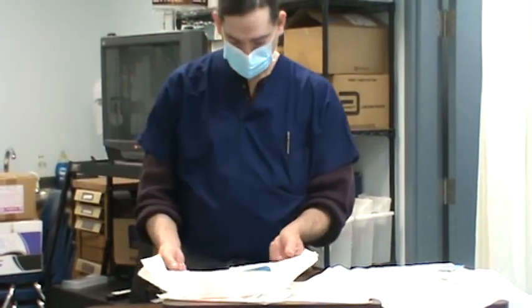So now I would next grab those gloves, but since I'm using these special gloves due to my allergy, once again, when I put on my gloves, pay attention to how I do it. I'm not going to contaminate them. And if I do, because sometimes the fingers flop around and hit the back of my hand, I'll just throw them away and grab my spare pack I always have with me.